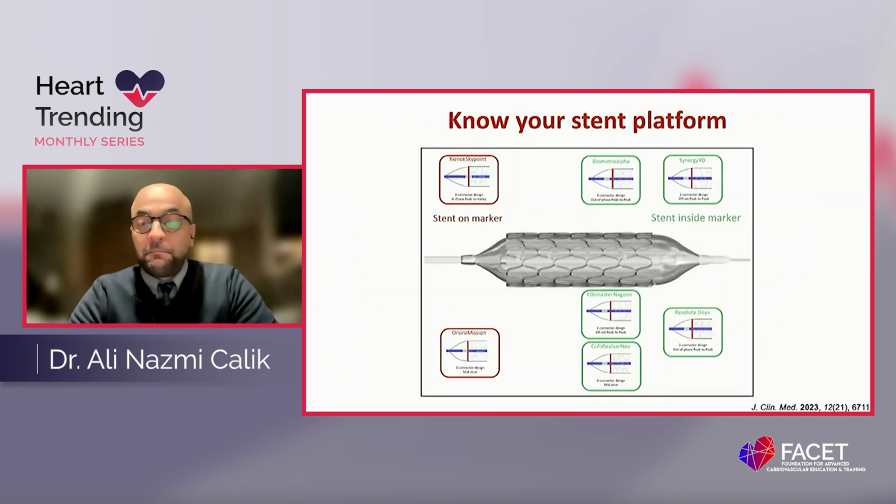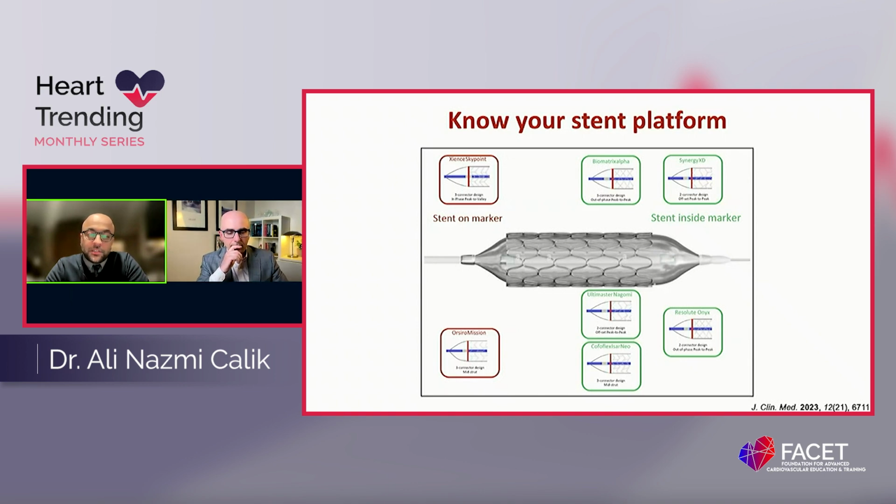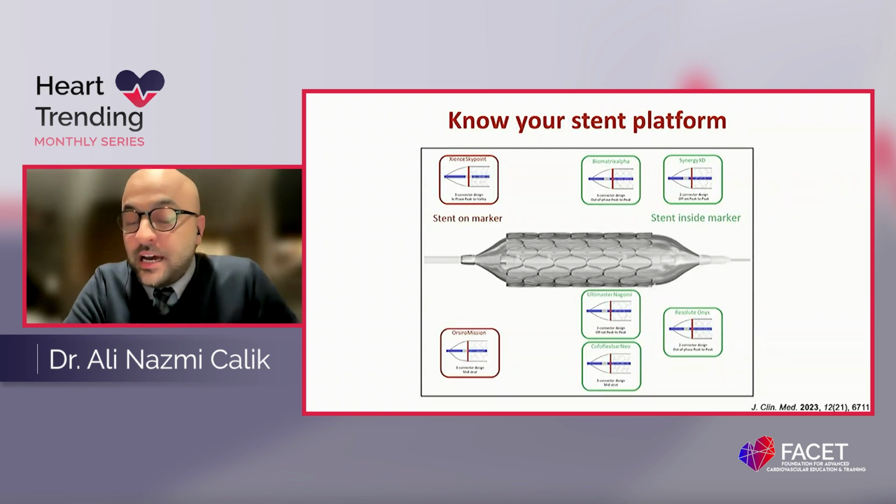Yeah. The one before, especially with the landmarks, not everybody pays attention to, especially for positioning. Yeah, so it's really important to understand which stent we use, and to recognize the stent we deploy, because if we don't know the relation between the radio-opaque marker, the indicator at the end of the stent, and the metallic struts, we may cause a geographic miss at the side branch ostium.